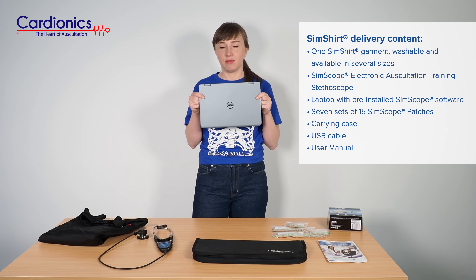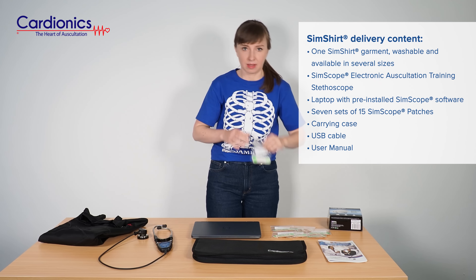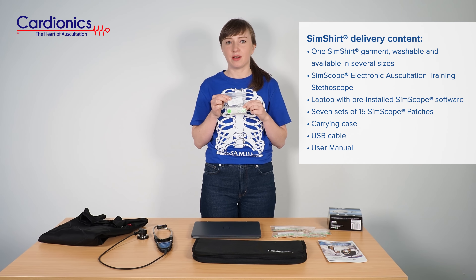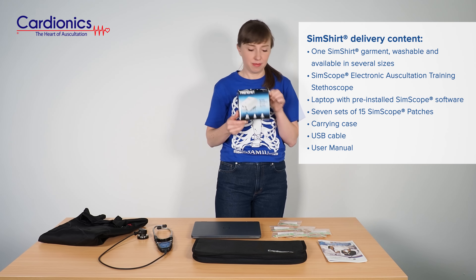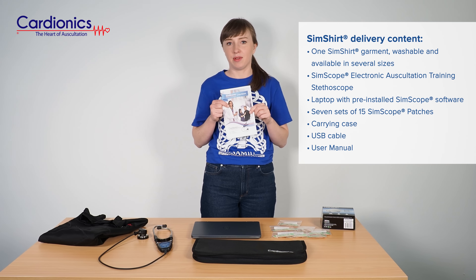Dell tablet with pre-installed software. Seven sets of 15 patches, which are to be placed either on mannequins or standardized patients. Router. And a product manual, which is also available online.